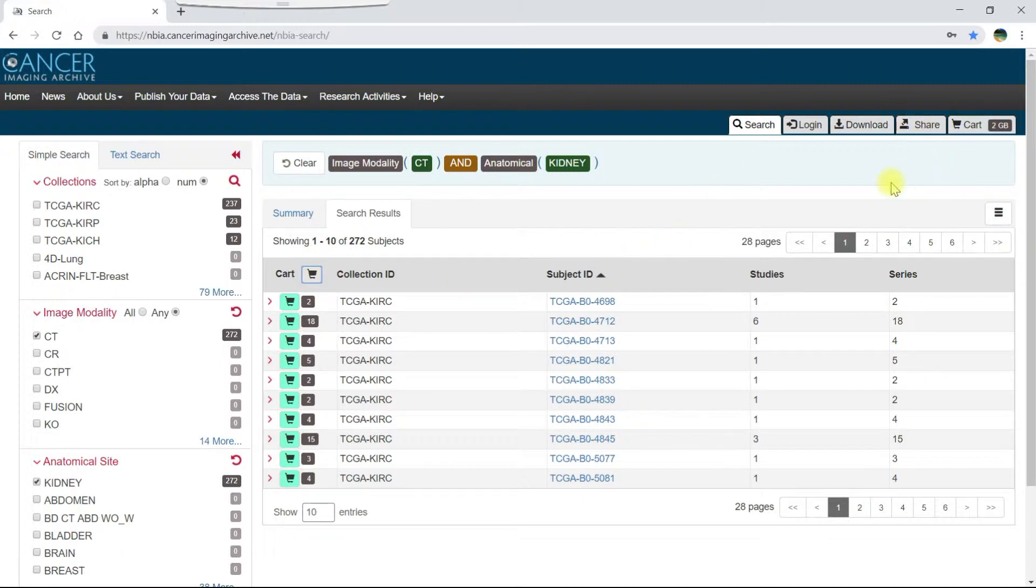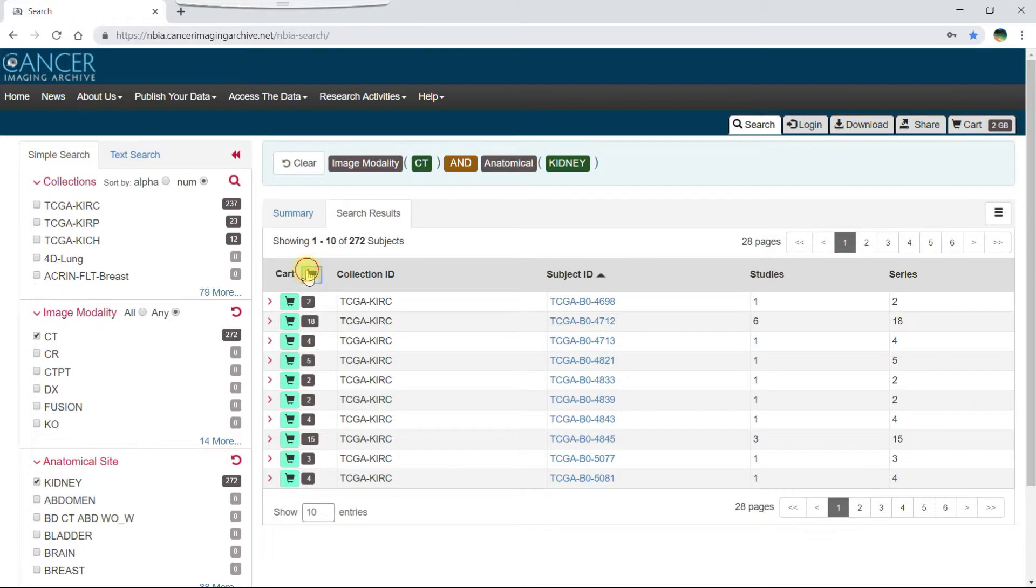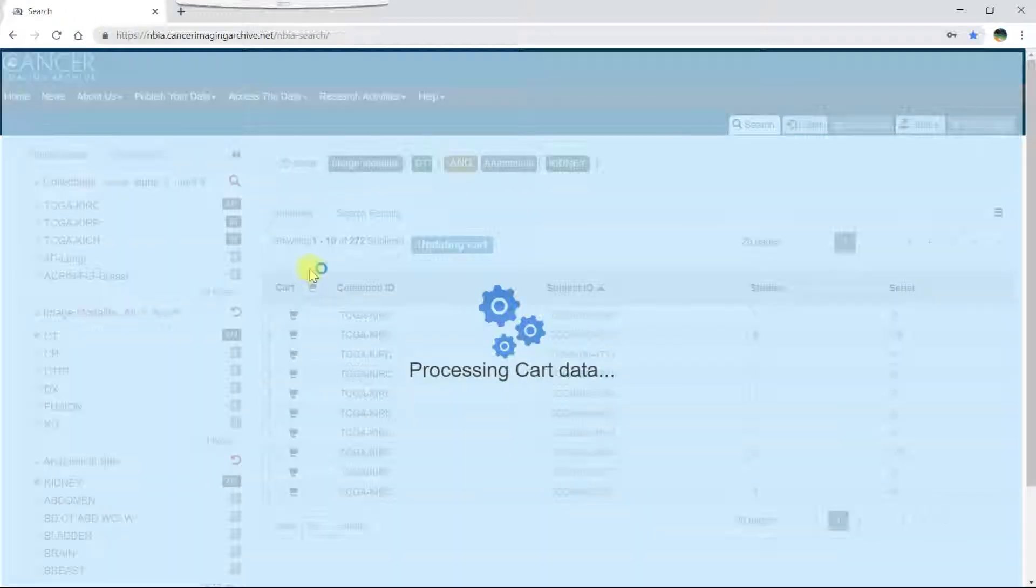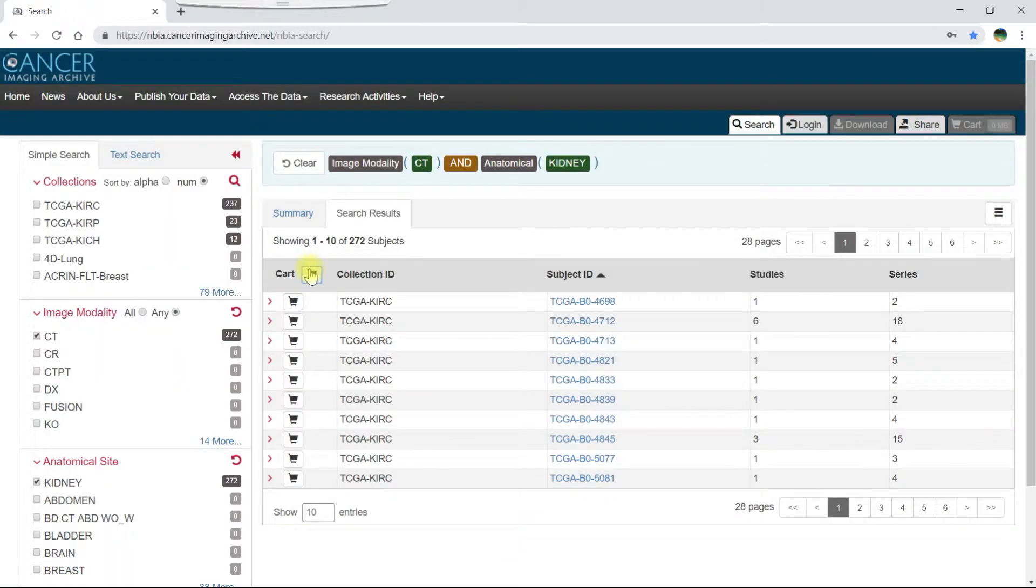Notice that when all results for a subject are in your cart, the cart button for that subject turns green. If you click the cart button again, the image results are removed from your cart.